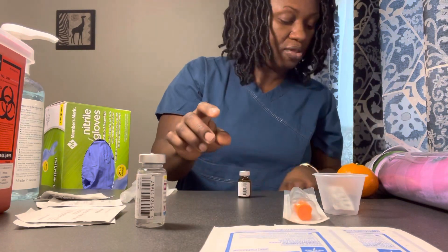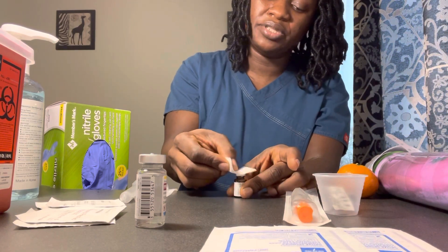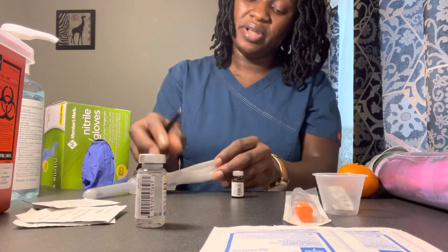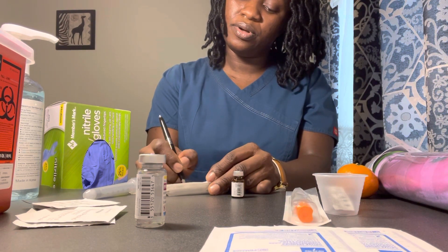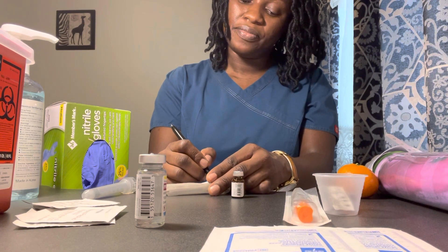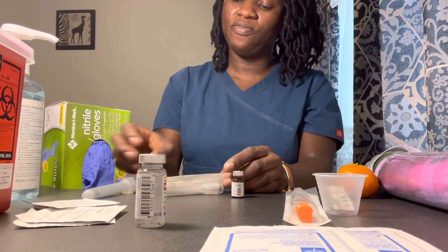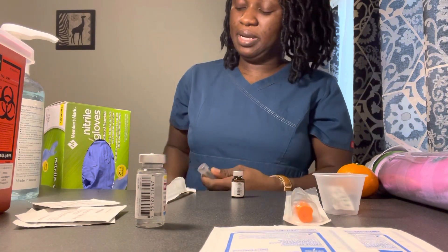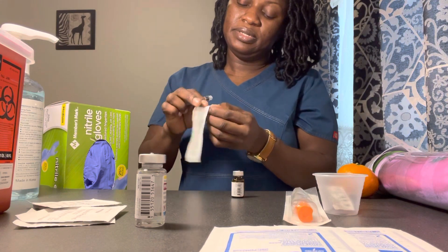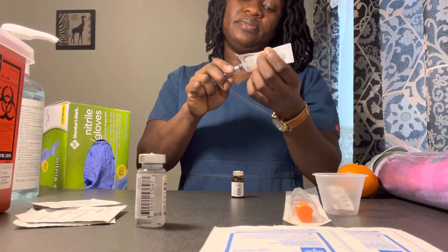I have my haloperidol two milligrams intramuscular. I have my alcohol swab — go ahead and clean the vial, make sure it's clean. On the pack I will write the name of the medication and dosage: haloperidol two milligrams IM. I am drawing 0.4 ml because my vial is 5 milligrams per 1 ml. I have my syringe with a 23-gauge needle.